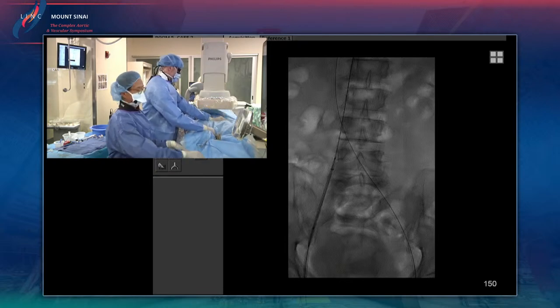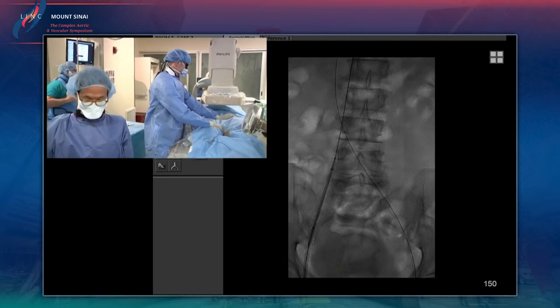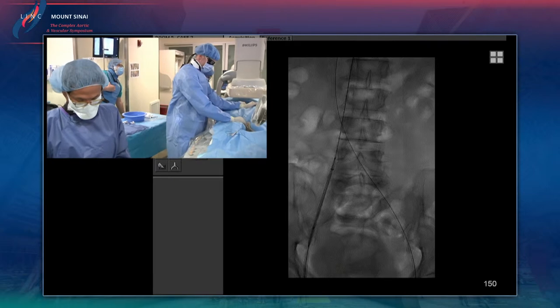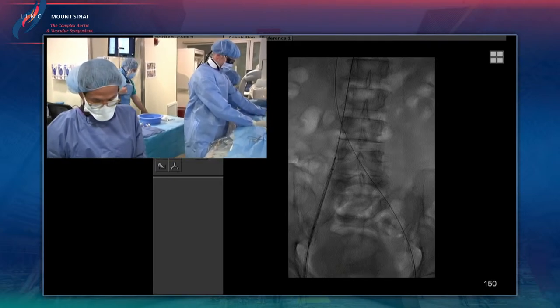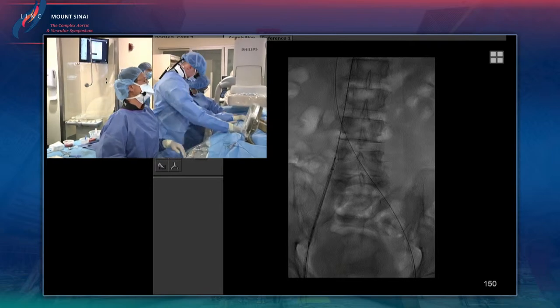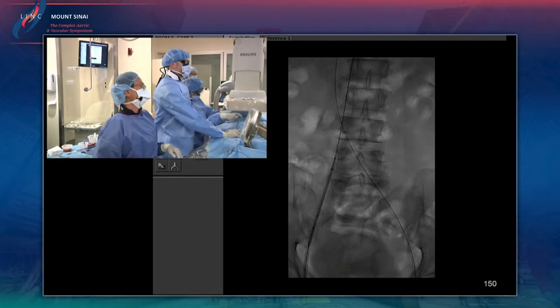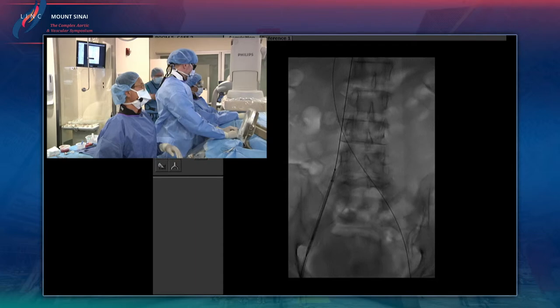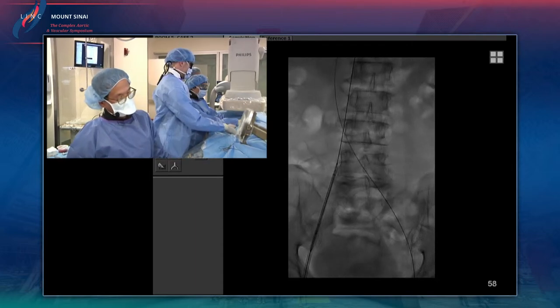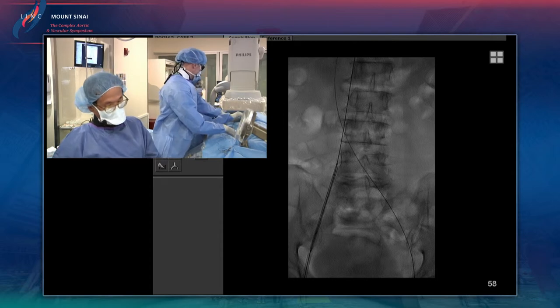So Windsor, do you want to share with us any technical tips or words of wisdom about how to land the wall stent, which I think we're all intimately familiar with its possible pitfalls, even though it's the most commonly used device in North America right now? How do you land this accurately and right? How do you make sure that it ends up where you want it to?